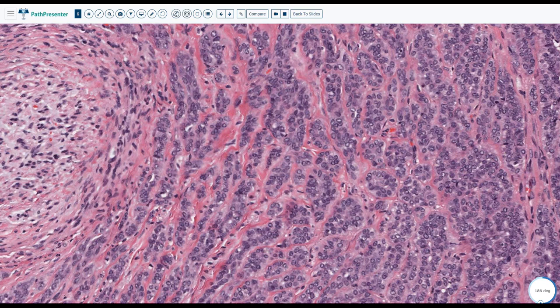So just try to exclude the other lesions and prove this is not especially squamous cell carcinoma. You can do P40, usually negative, but P63 doesn't exclude squamous cell carcinoma because P63 is positive. Okay. All right.